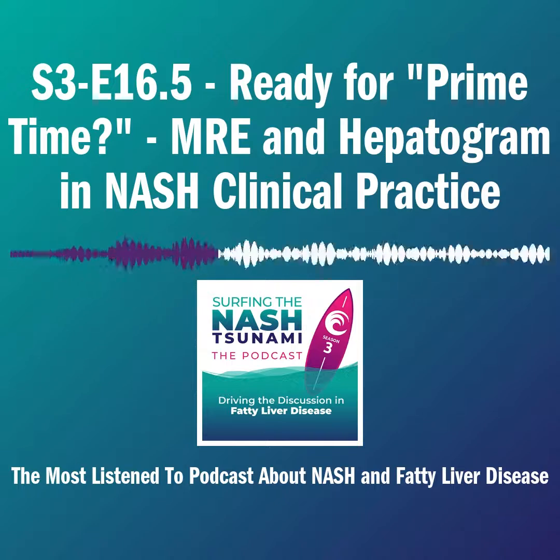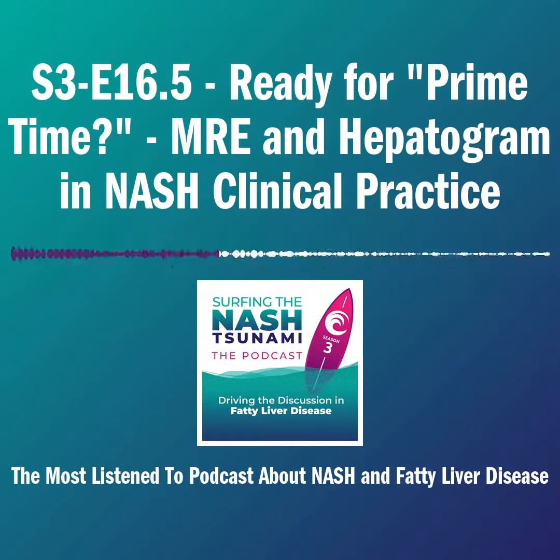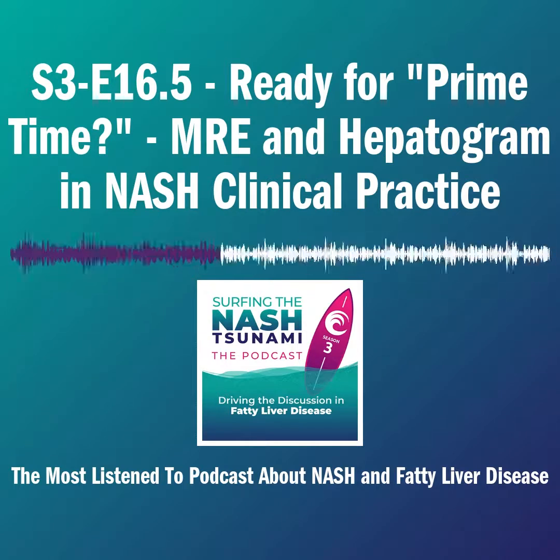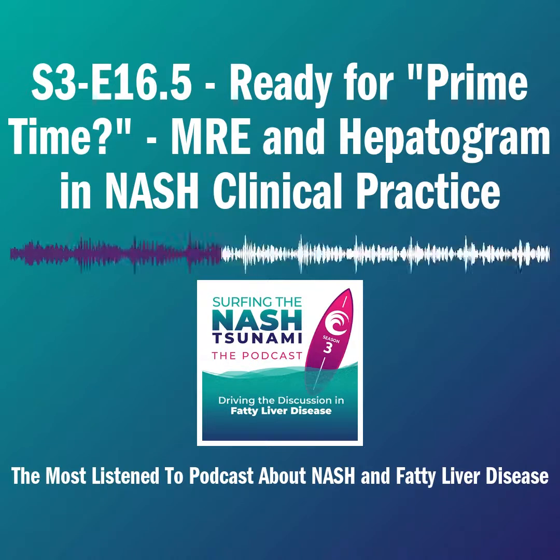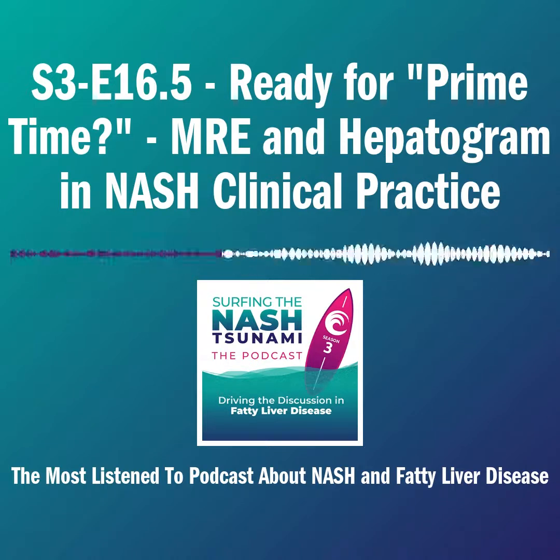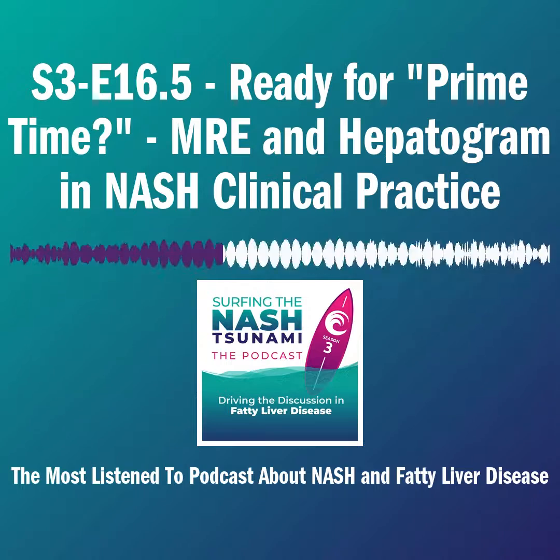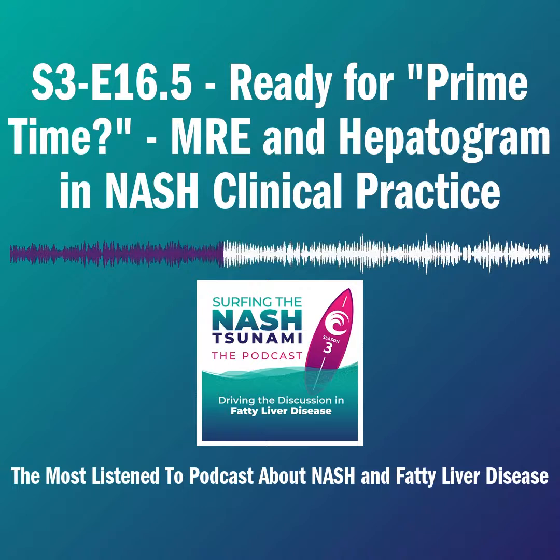The only other piece of this that is a slight complication, PDFF can be used as the regular scanner with just software in order to acquire the images and reconstruct the images. Elastography does require the additional driver equipment, which does add to the capital cost somewhat, and it means that you have to have this on any scanner that you want to do it on. But we actually have this on all of our scanners at Wisconsin, and so from our point of view, access is exactly the same. That may not be true at your local institution, so you want to know how many scanners and which scanners have elastography.